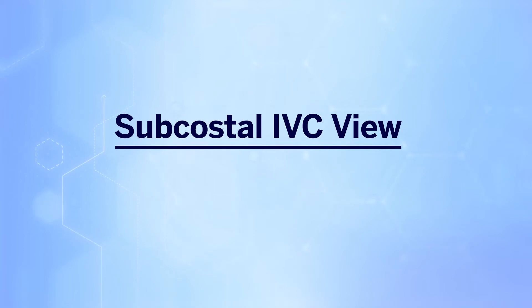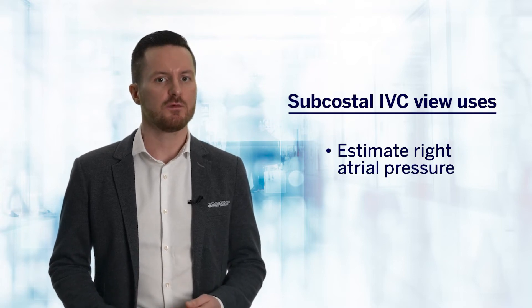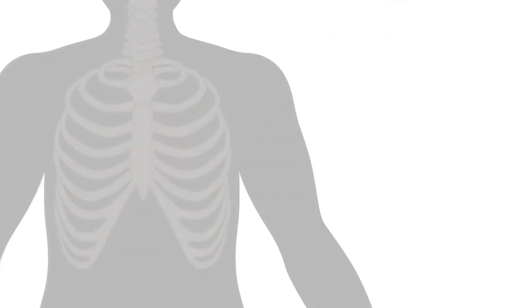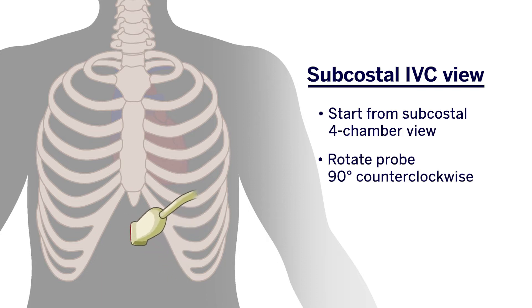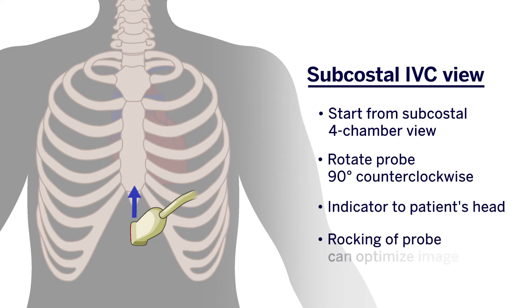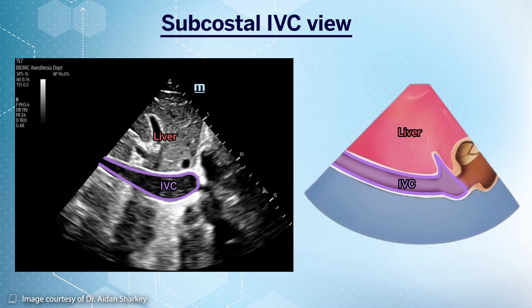The final view we're going to discuss is the subcostal inferior vena cava view. This view is often used to estimate right atrial pressures and to assess for fluid responsiveness. To obtain this view, we usually start from the subcostal four-chamber view and rotate the probe approximately 90 degrees counterclockwise so that the indicator is facing towards the patient's head, or the 12 o'clock position, as indicated by the blue arrow. Gentle rocking of the probe will allow image optimization and bring the IVC into view. We should be able to identify the liver, inferior vena cava, and the right atrium. It is very important to see the IVC merging into the right atrium, as the abdominal aorta is also in this vicinity and can be easily mistaken for the IVC.